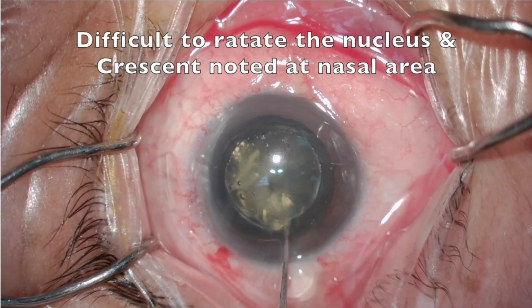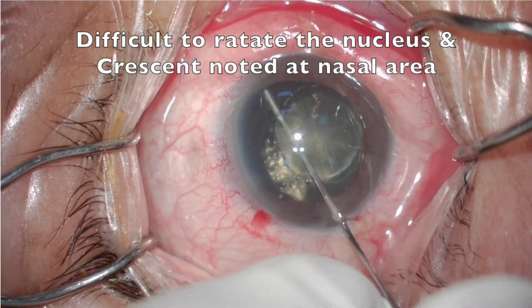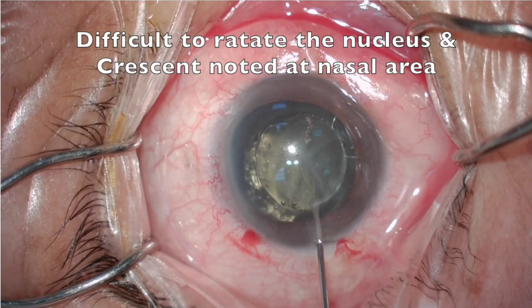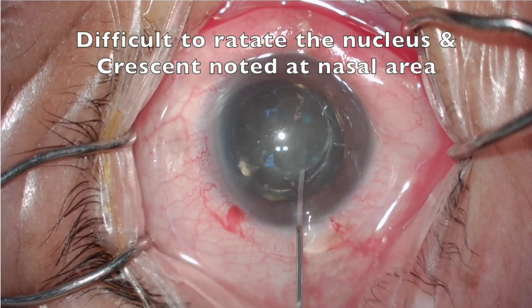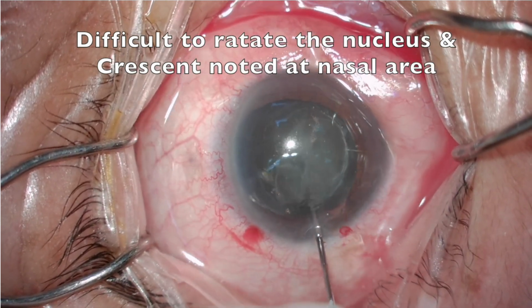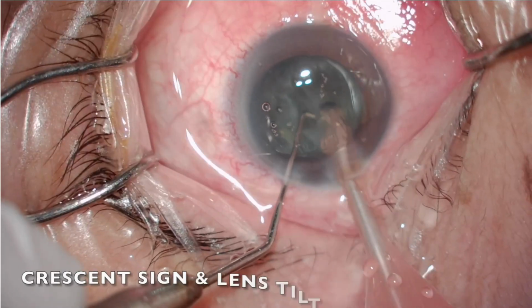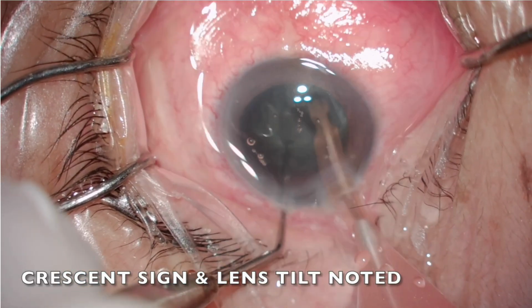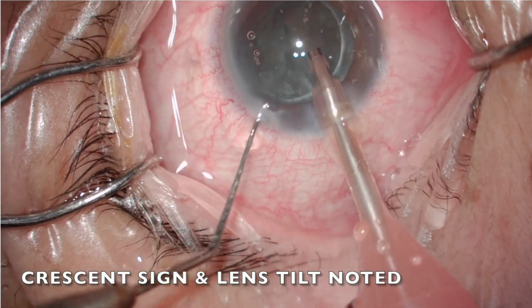When I was doing hydrodissection, I found it difficult to rotate the nucleus and there is a crescent sign noted at the nasal area. This suggests zonular dialysis at the nasal area. I should use low parameter phacoemulsification, low IOP, low flow rate, and low vacuum to remove the nucleus. I prefer the stop and chop technique. After sculpting, I divide the nucleus. I found the nucleus is sinking.